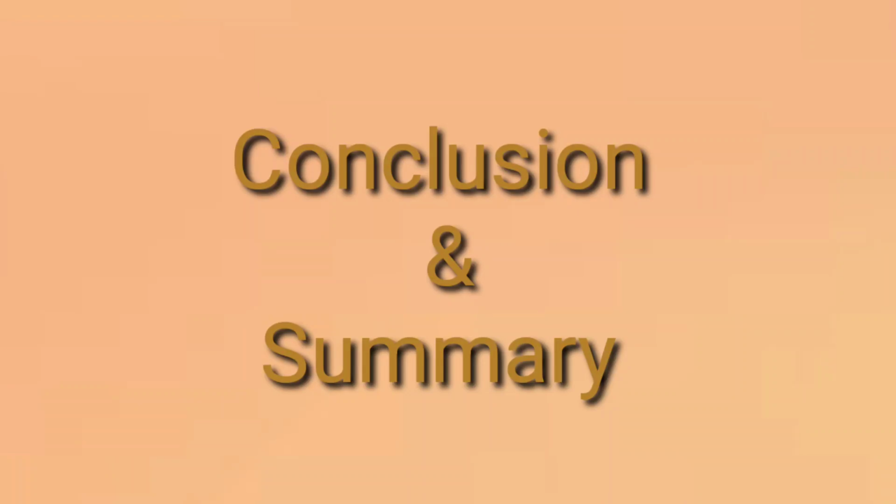It's a perfect modality for that. And so far as the staging is concerned, on the basis of staging you can confirm whether it is a resectable or non-totally resectable tumor. So I do hope that you would benefit from this video, and you will apply all this knowledge while you are scanning the patient, and you will also look for all these points at length.